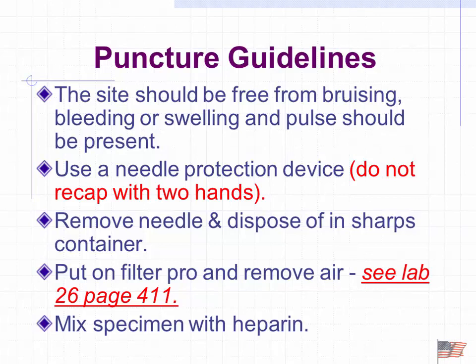Once we're done, the site should be free from bruising or bleeding or swelling, and you should be able to palpate a pulse. One of my habits that I always got into is after I got done with the blood gas, analyzed it, and got the results back up to the floor, I would go back and recheck that patient again to see what the wrist looked like to make sure there was not any damage there. I don't recommend putting a Band-Aid on it, no. Some people do, and there's Band-Aids in the kit. My personal preference was I always wanted to be able to see that site if there was damage to it.